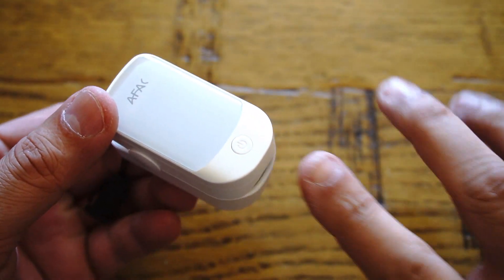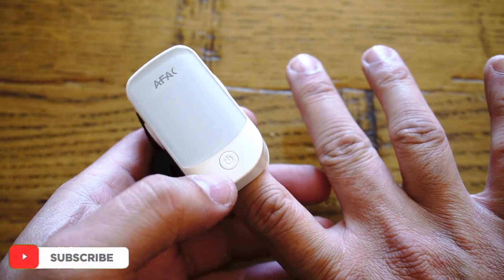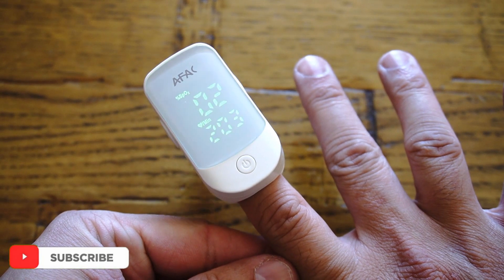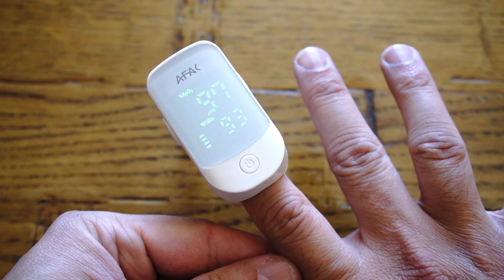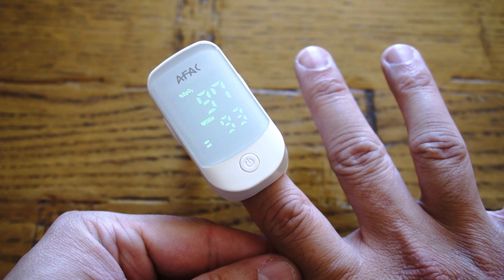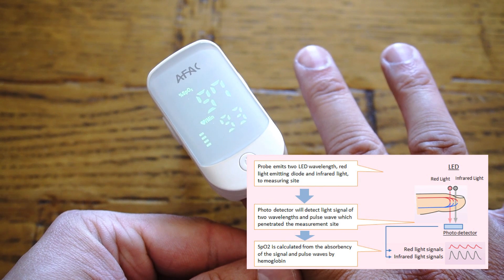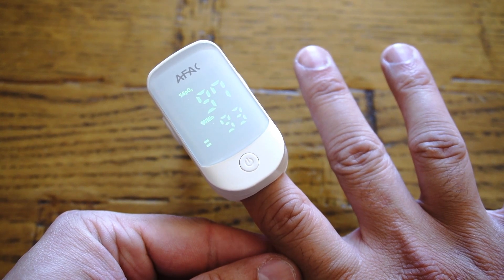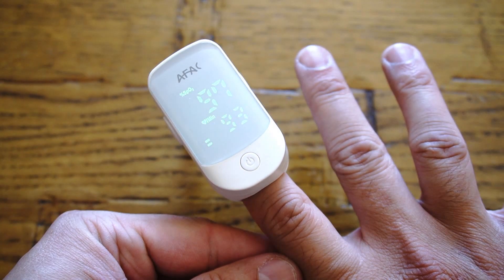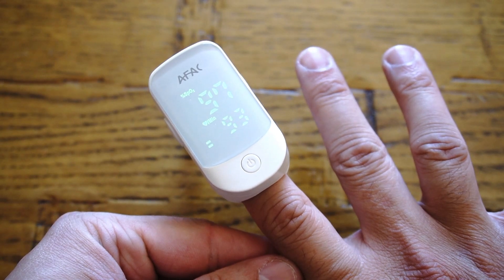This pulse oximeter by AFAC is very straightforward — press one button and it displays your SpO2 and pulse rate. In my personal opinion it's very essential to know how it works. A small beam of light passes through your blood and finger to measure the amount of oxygen. It does this by measuring the change of light absorbed in your oxygenated or deoxygenated blood. This is a painless process, so there's no hurt to your finger or any pin involved, and it will tell you your oxygen saturation level along with your heart rate.